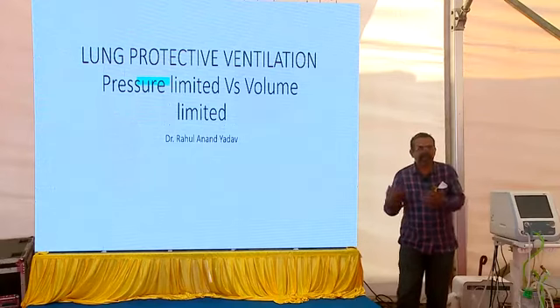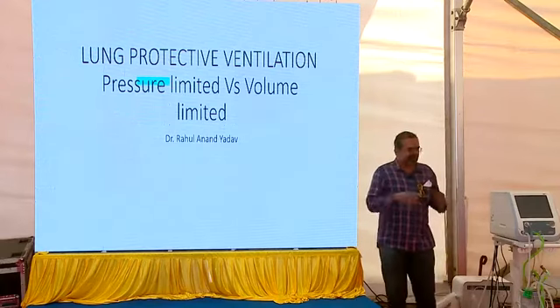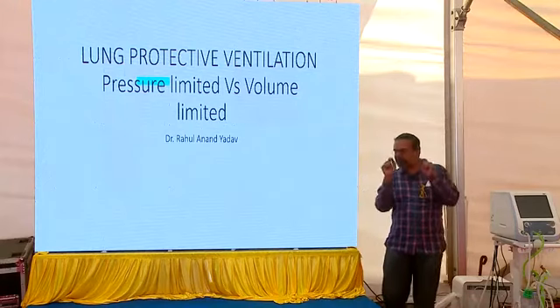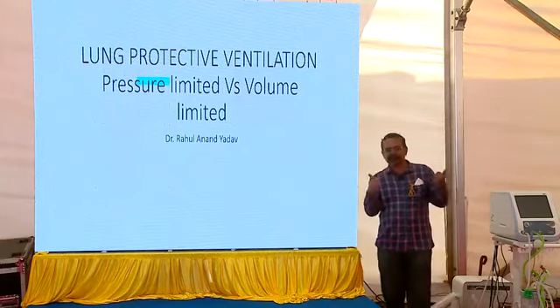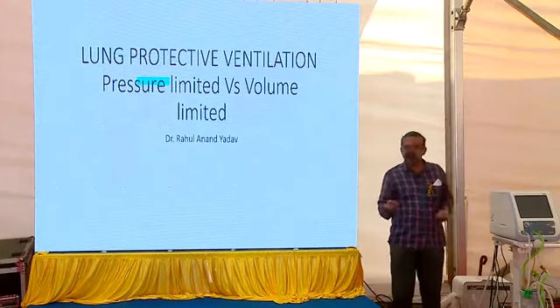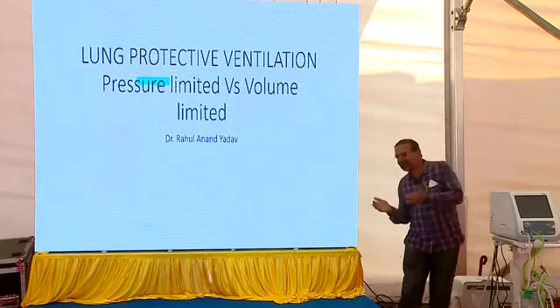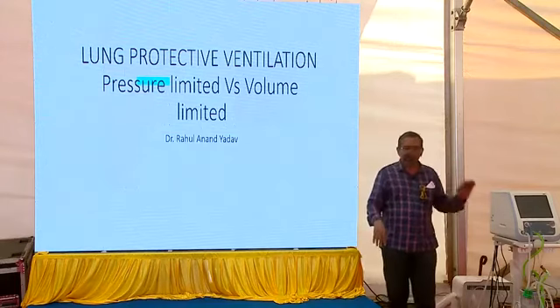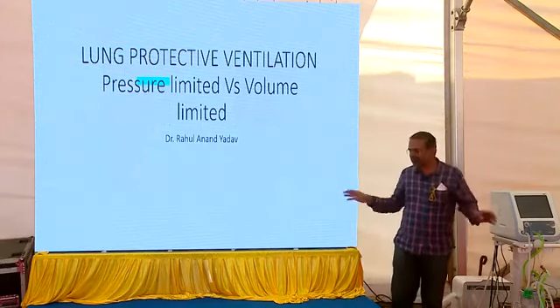So I got the message that your stand is something based on your passion. You like something doesn't mean that it is perfect. Nothing is perfect. Pressure is not perfect, volume is not perfect. So we have to individualize the patient for volume and pressure, because I have done both. After doing both for many years, I gravitated to this side, but I should know that neither pressure nor volume is the ideal mode of ventilation.